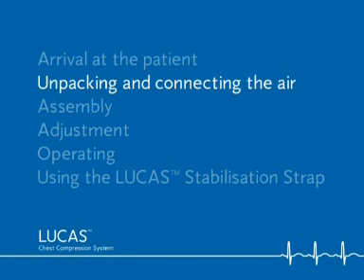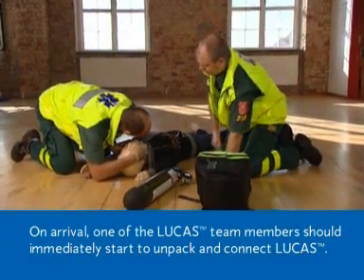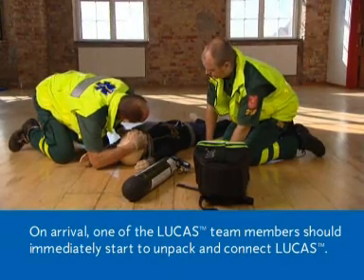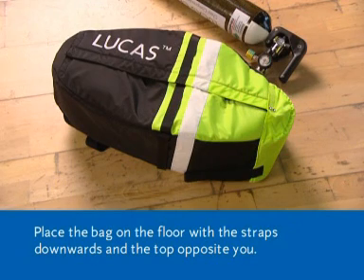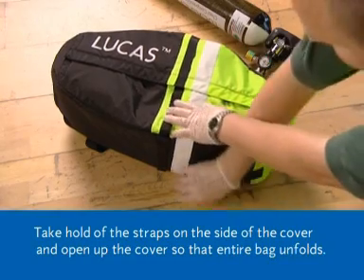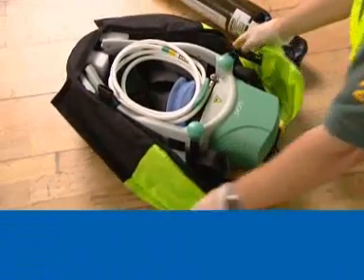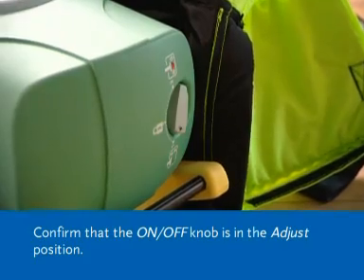Unpacking and connecting the air. On arrival, one of the Lucas team members should immediately start to unpack and connect Lucas. Place the bag on the floor with the straps downwards and the top opposite you. Take hold of the straps on the side of the cover and open up the cover so that the entire bag unfolds. Confirm that the on-off knob is in the adjust position.